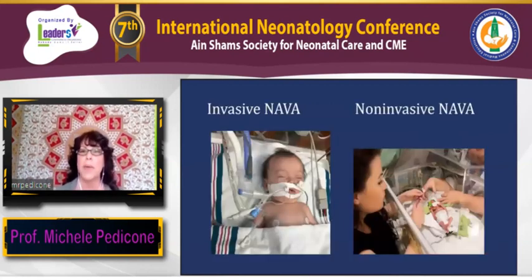So here's a picture of a baby on NAVA. NAVA, in my experience, has been used in the NICU. So this is where I have used NAVA. However, we are seeing some success using NAVA in COPD patients, so you can keep that in the back of your mind. NAVA is a mode of ventilation that can be used for itty bitty babies, preemies, very low birth weight, and also elderly patients or those with COPD.